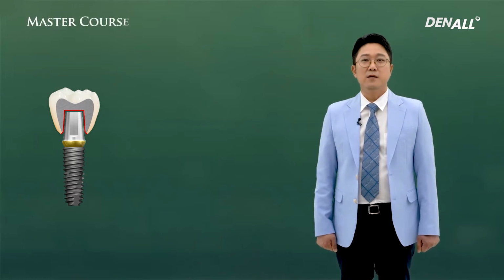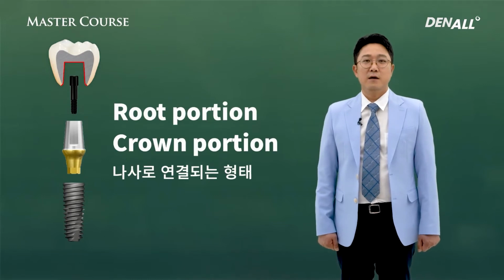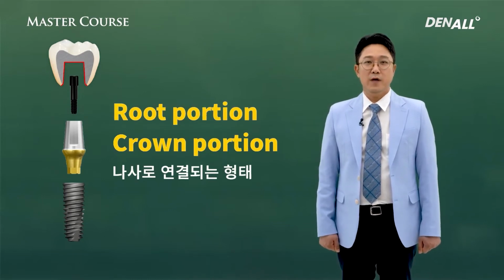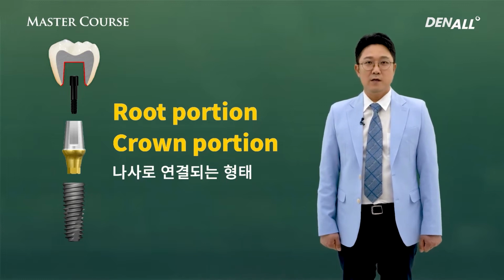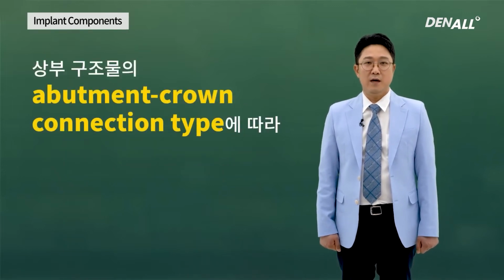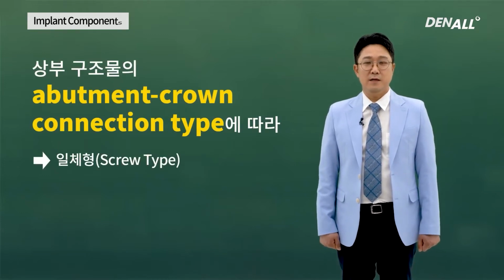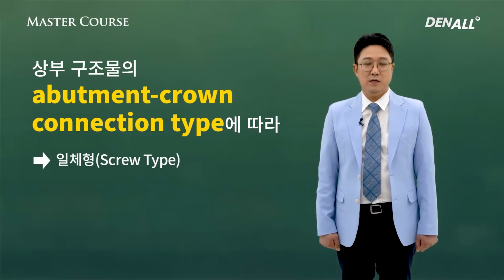To summarize, the components of an implant include the fixture, which is the tooth's root, and the abutment, which is the cervical area of a tooth, and on top of it, the crown is connected with a screw. Among these, the superstructure can be divided into 3 different options, depending on how the abutment and crown are connected. First is the one-piece screw type, where the abutment and crown are fabricated as one.